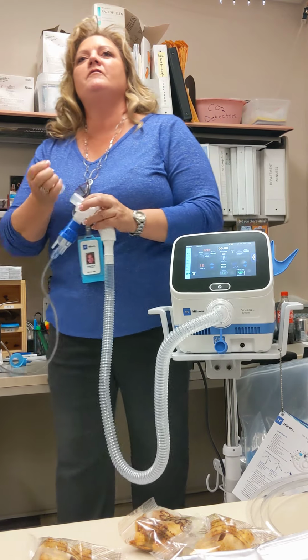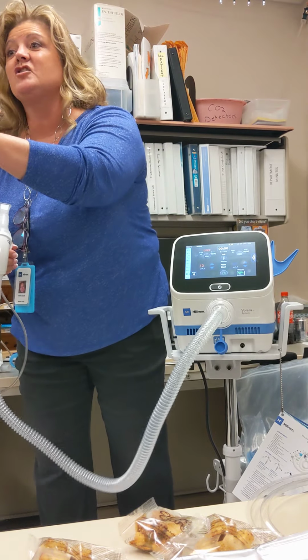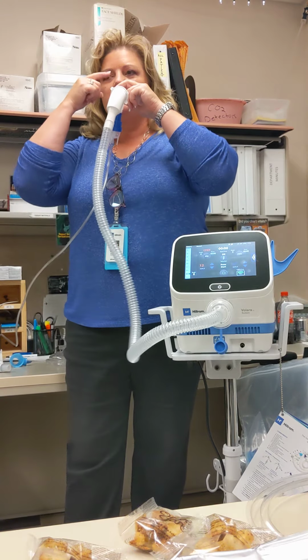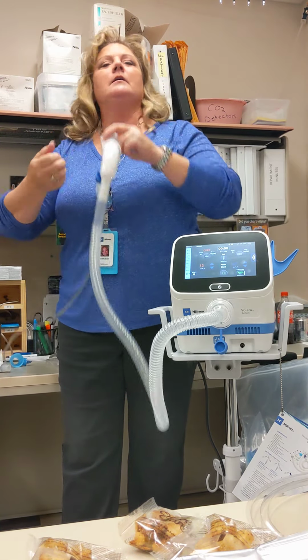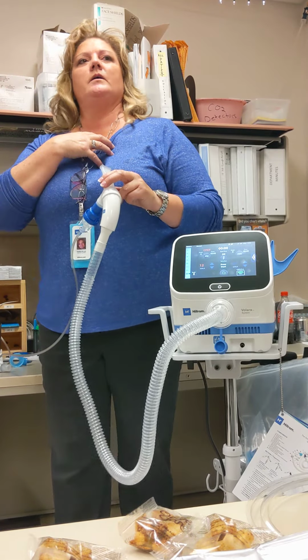When they're doing the mouthpiece, do we do a nose clip? No. If their nose starts itching, that's good. That means they're getting good chest wiggle. Vibration goes into their nose and all of a sudden they're like, my nose itches. So don't plug their nose. That's a good sign. That means we're getting good chest wiggle.